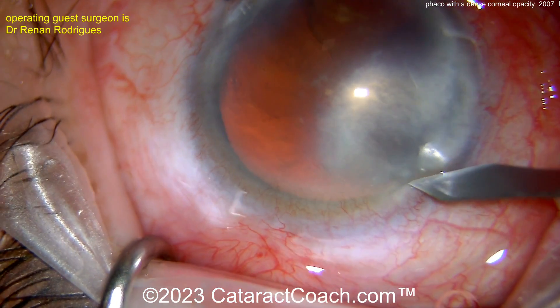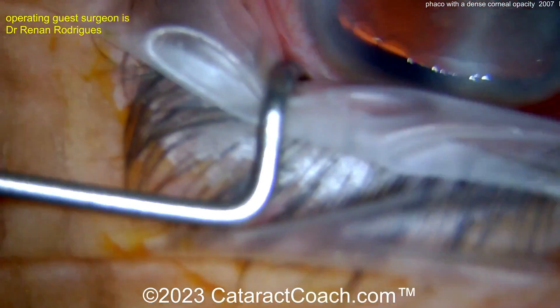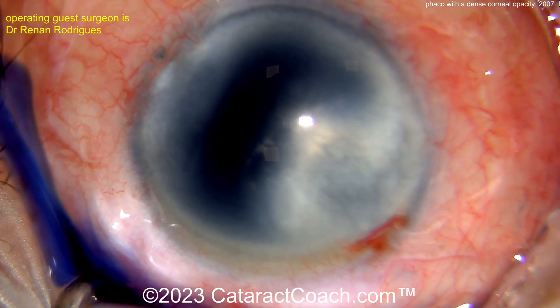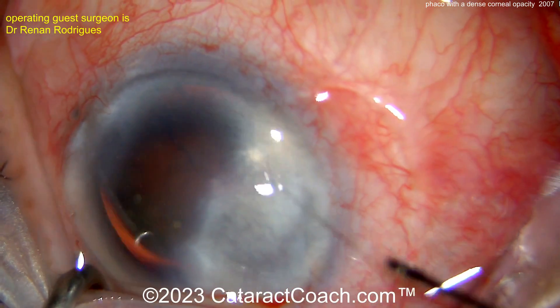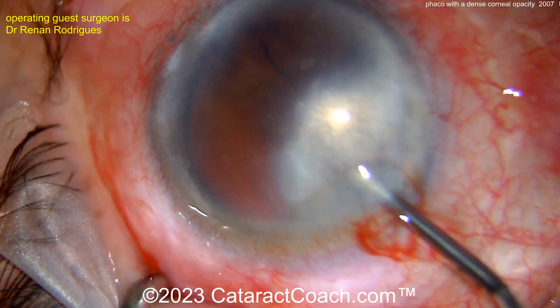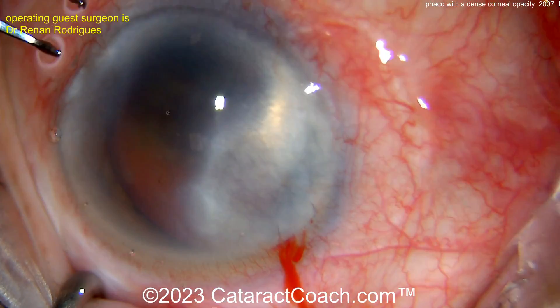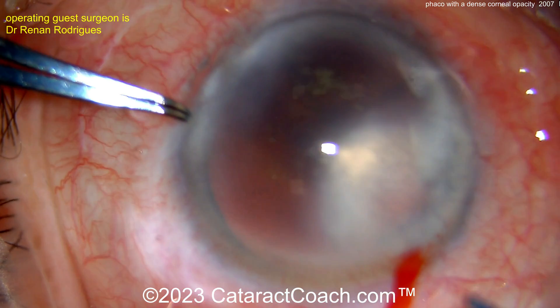There's a very dense corneal opacity. Some people may say, why don't you just do a combined procedure — a corneal transplant plus cataract at the same time? Believe it or not, patients can sometimes have these kinds of corneal opacities and still have reasonably good vision. It's a very reasonable approach to first try doing just the cataract surgery and see how the patient does, what vision is achieved. If the patient's happy, then you're done. And if needed down the road, you could do a corneal transplant.